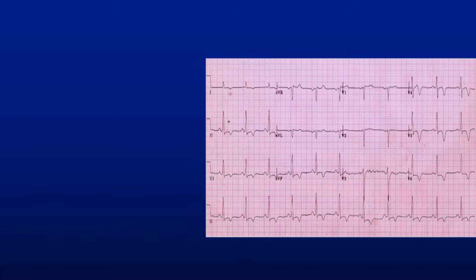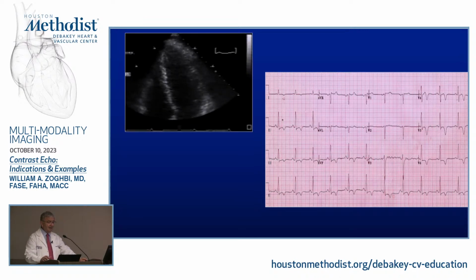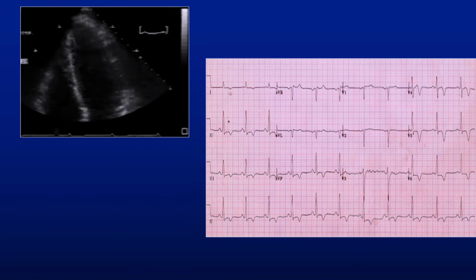All right. As you could tell, I like to build on historical themes. This is another historical theme. Mike Quinones would remember this very well. So our live courses in Bethesda. And this patient actually came in Georgetown. This patient came the night before with chest pain. Not your normal EKG. And this is the echocardiogram. So I want you to think of how you interpret this echocardiogram. This is what you see.